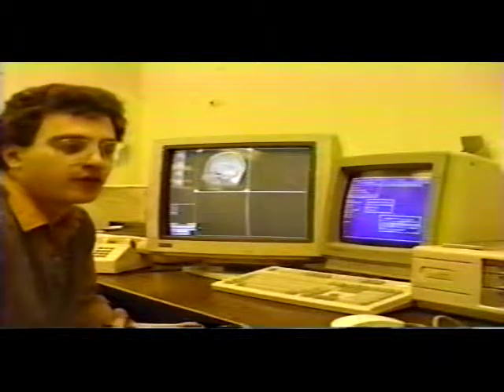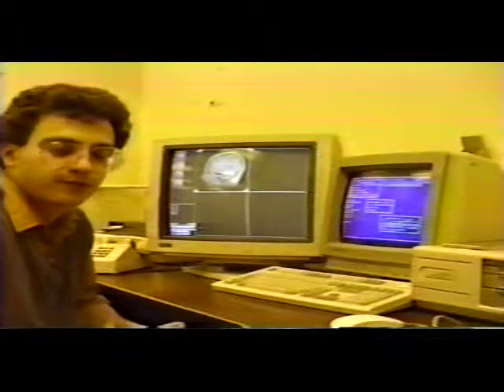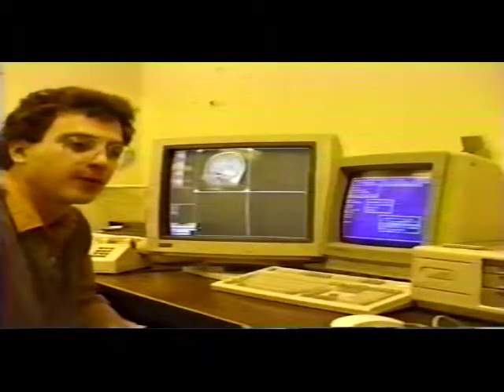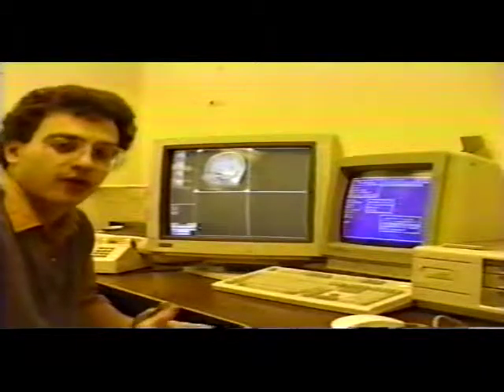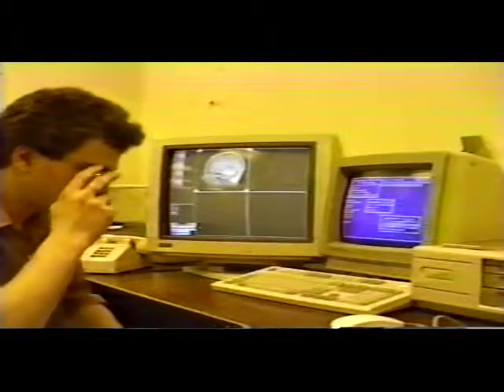And an interesting note is that from November until approximately January of this year, I was using a faulty controller that was writing bogus information to the disk, approximately 1 out of every 3 or 4 writes. I didn't detect this for 3 months because the file system was discovering that and simply rereading other copies or trying to make do with invalid information. I didn't even notice it.